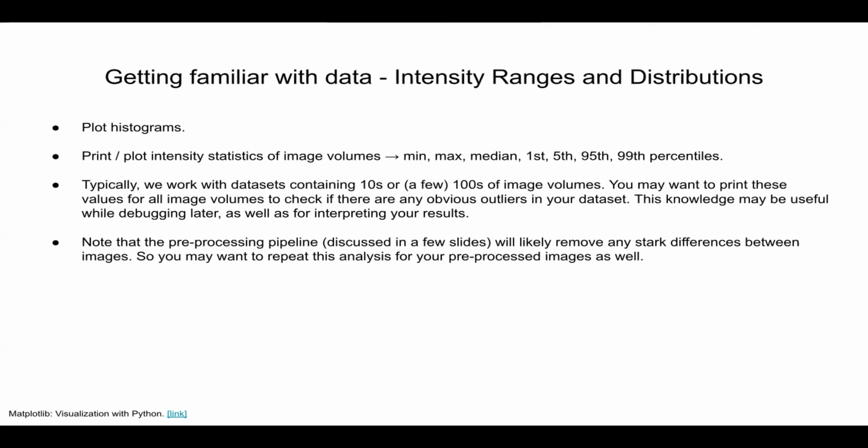It's worth noting that the pre-processing pipeline that we will discuss later will likely remove a lot of these differences, and therefore it might be useful to repeat this kind of analysis after the pre-processing pipeline as well.